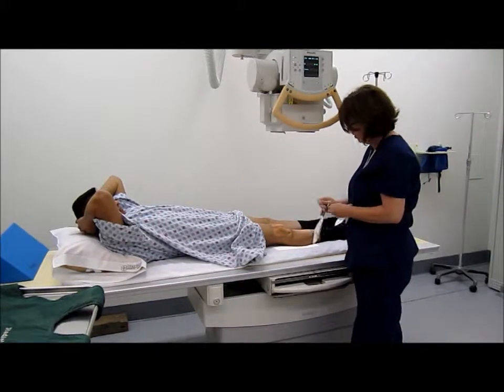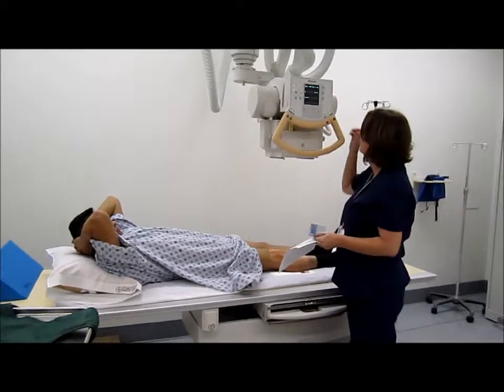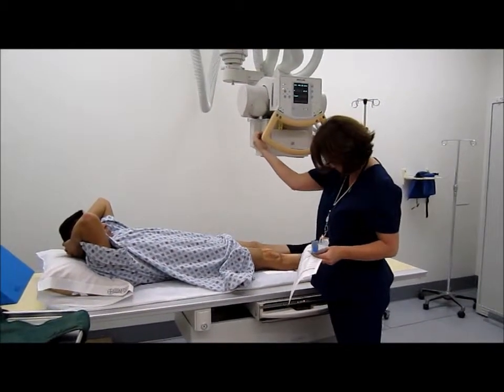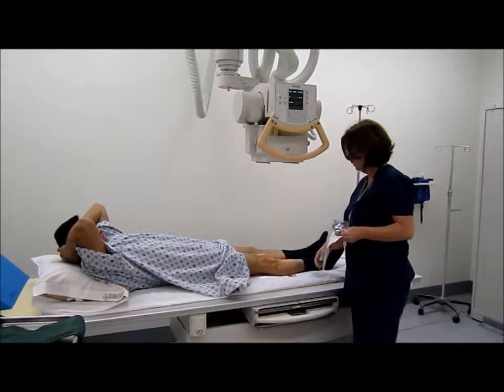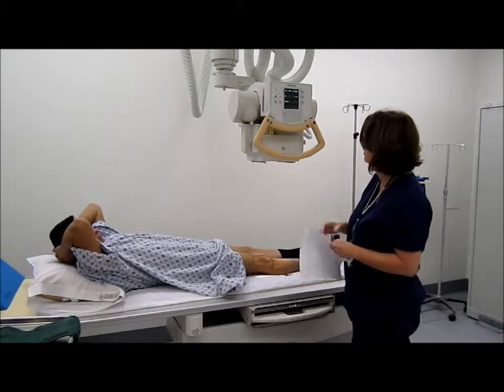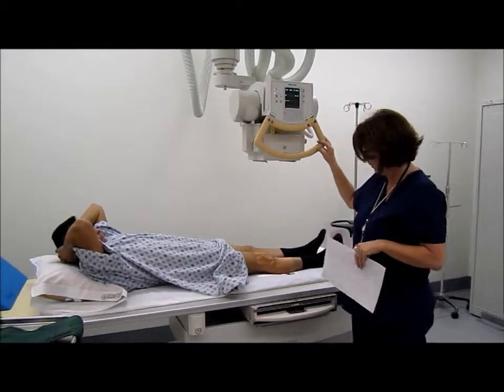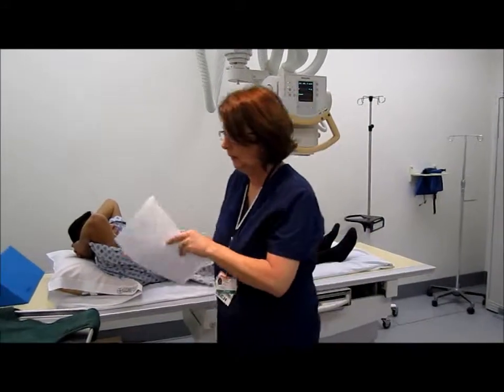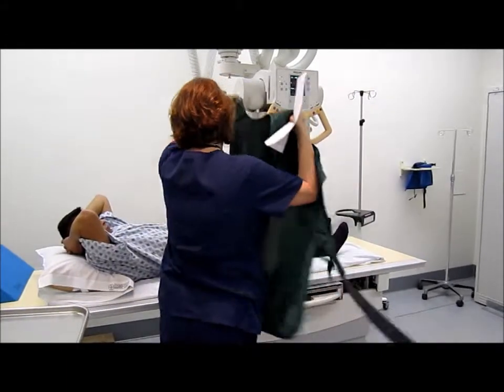Place my right marker on the bed right next to the patient's stomach. I'm going to collimate my light in, 1 inch around, all the way around the knee. And then I want to shield the patient.